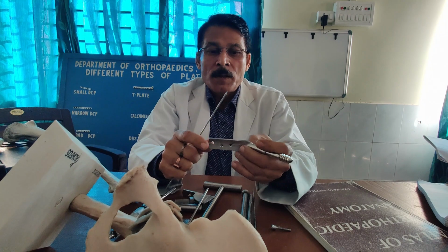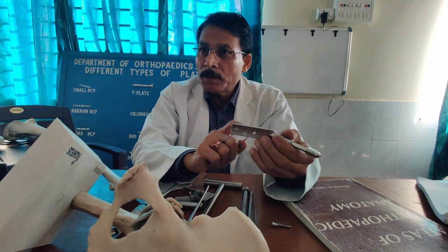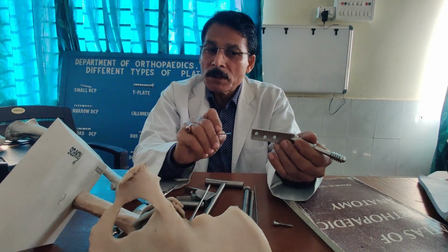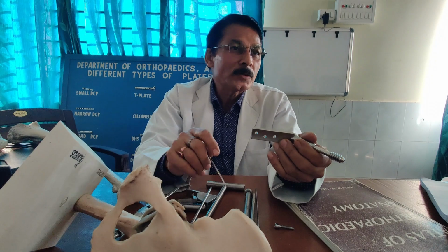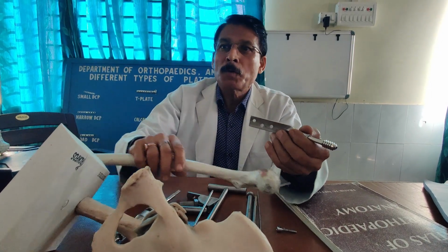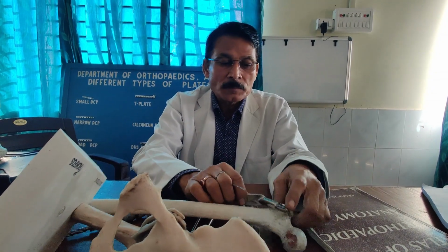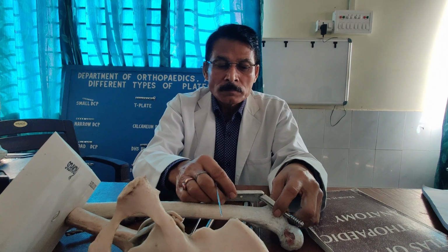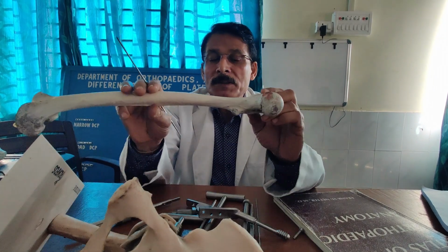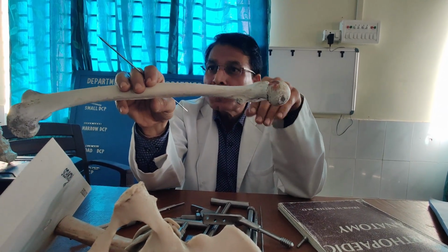Okay? Again I told you one thing: while doing the fixation, when the plate is already introduced, the last screw is the first to be applied. Why so? That is very important. Because of the weight, there is every tendency that the angulation will be posterior.